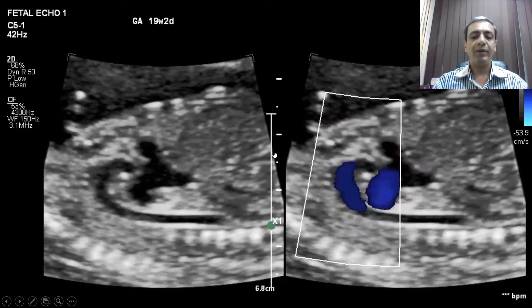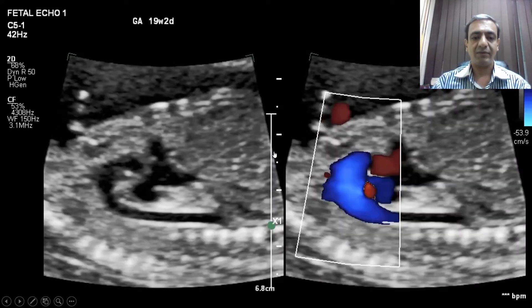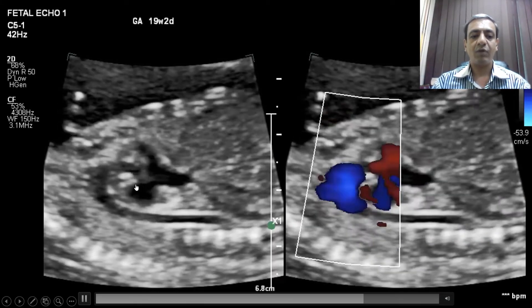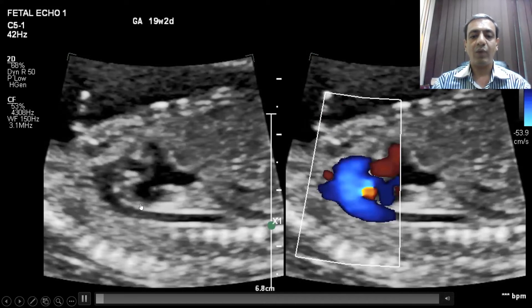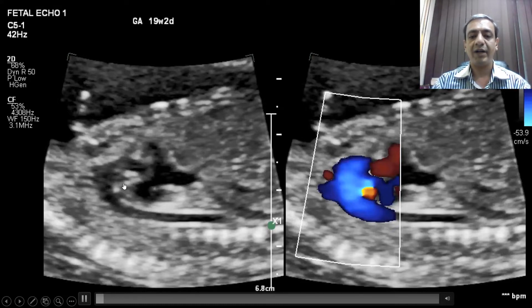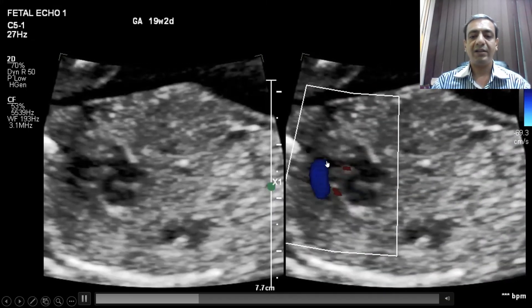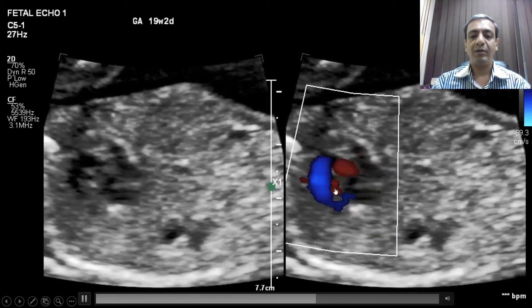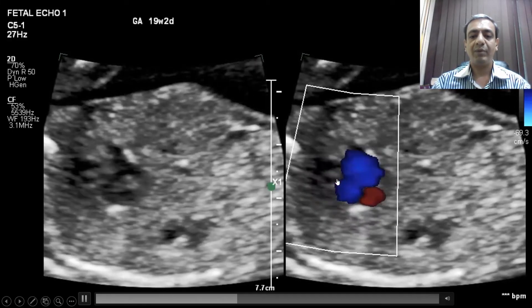Now coming to flow reversal in the arterial duct — look at this aortic arch where forward flow is seen in blue color, while there is flow reversal seen in the duct. This is a flow reversal in the duct. The pulmonary artery is difficult to appreciate in this video. Again, this is the aortic arch and this is the flow reversal in the duct and pulmonary artery.